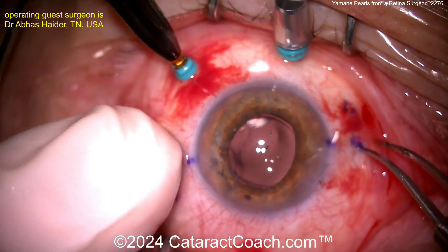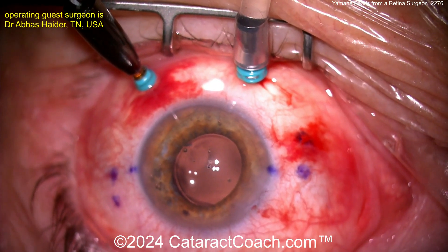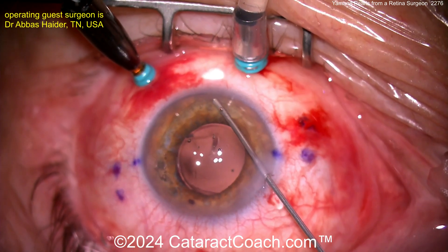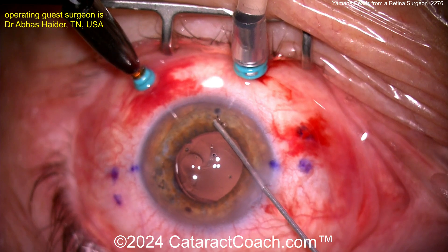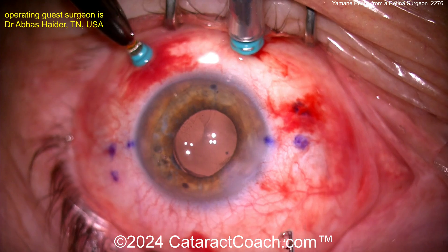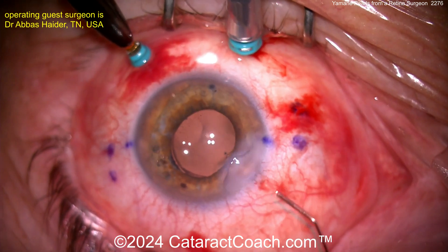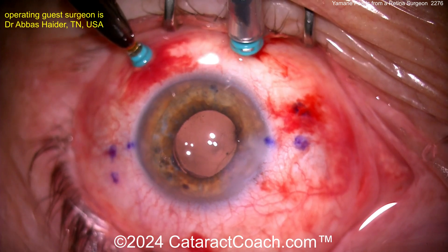A nice procedure for a retina specialist. You want to be able to do a full pars plana vitrectomy if you're going to do this technique, and the patients have beautiful outcomes. When anterior segment surgeons are doing a Yamane, sometimes they forget to do a thorough enough anterior vitrectomy, and with manipulation of the lens you can tie up vitreous strands in the haptics — that's why we've seen an increased rate of cystoid macular edema in some of these cases done by an anterior segment surgeon. So referring these patients to your local retina surgeon is a fantastic idea, or you can try it yourself. I tend to prefer the teamwork approach — it makes life a whole lot easier.